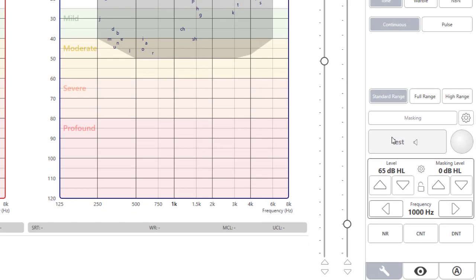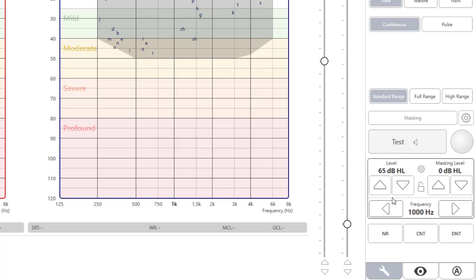The audiometer can be operated with the keyboard or the mouse. To present a tone with the mouse, click on the test bar. To change levels, use the presentation and masking level arrows.